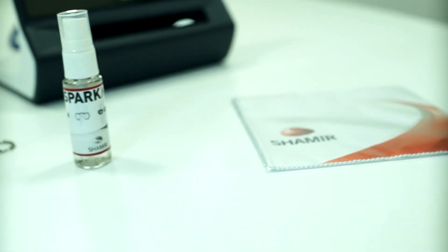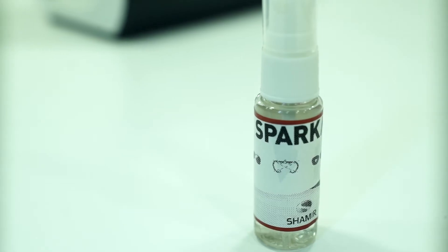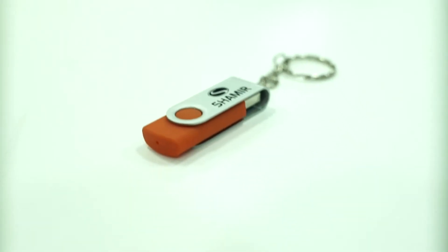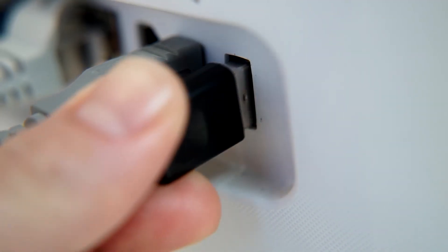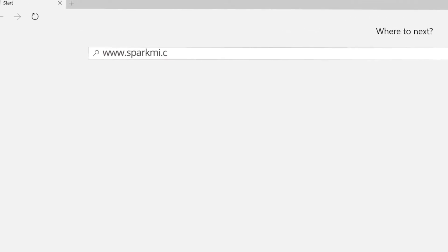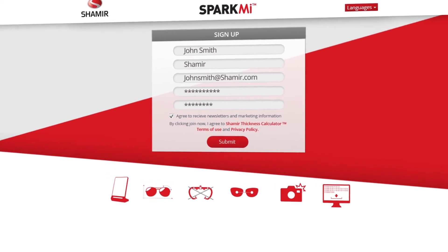The Spark Me package consists of the Spark Me measurement device, cleaning cloth, cleaning spray, and USB device. First, connect your Spark Me device to your computer using the USB cable. Visit the Spark Me website at www.sparkme.com to set up an account. You will need to register by completing a short form with your name, company name, country, and credentials.